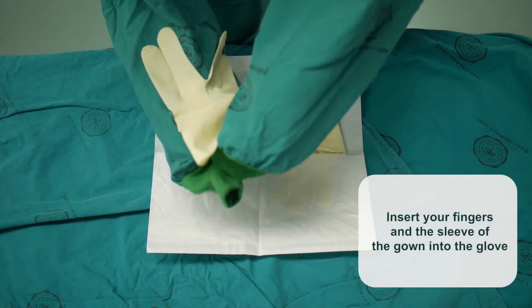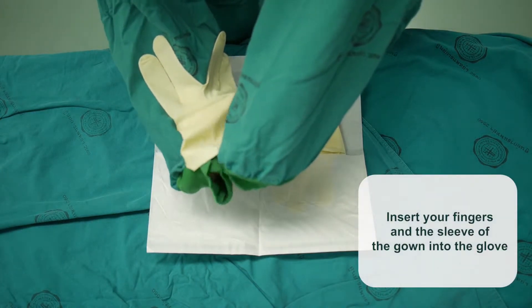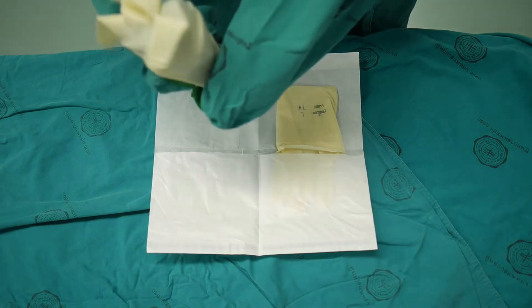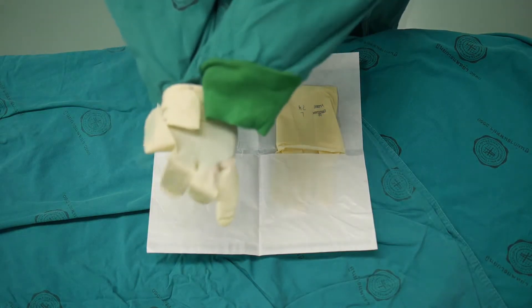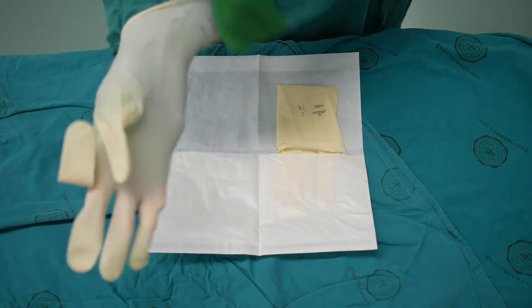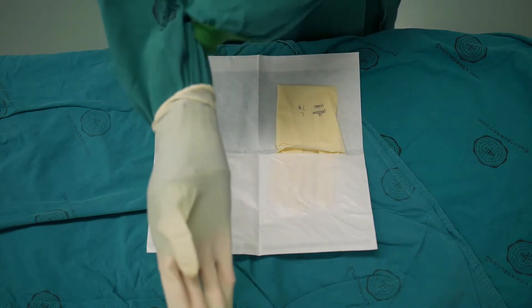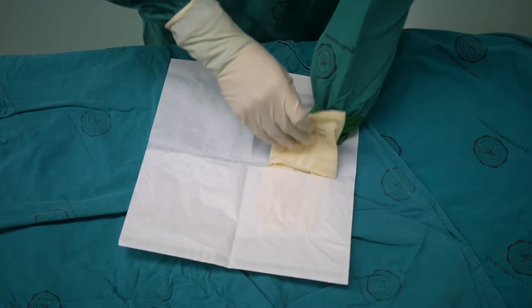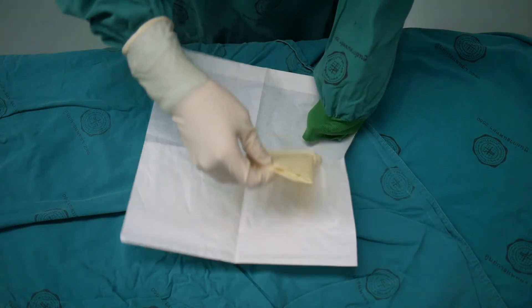Insert your fingers and the sleeve of the gown into the glove. Adjust the glove as shown. Repeat the process to glove your non-dominant hand.